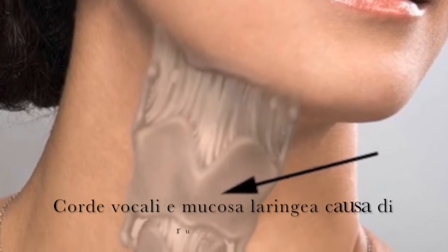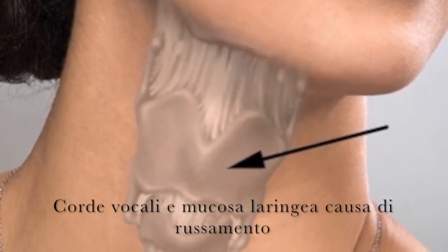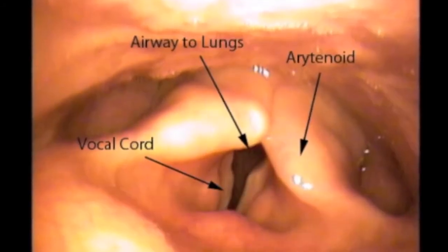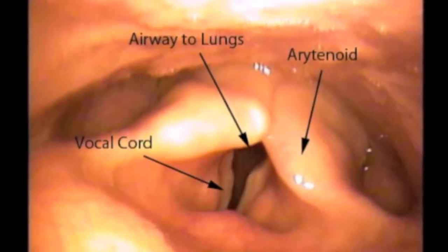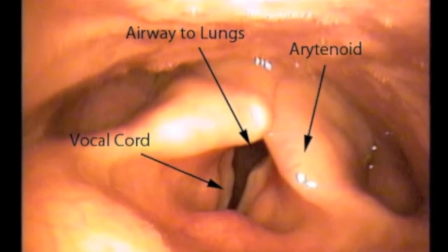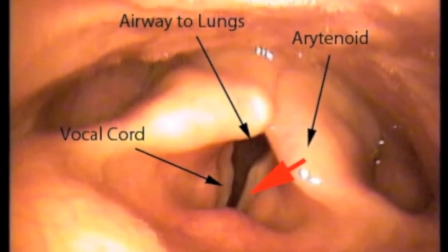A final source of a snore can come from the voice box itself. In this video, you can see the mucosal folds above the vocal cords known as arytenoids collapsing into the airway and vibrating causing a snore.